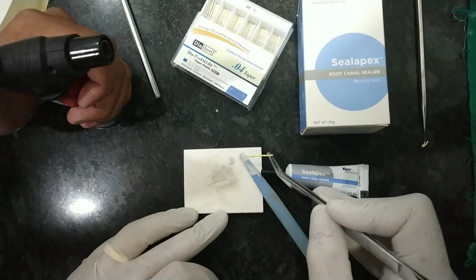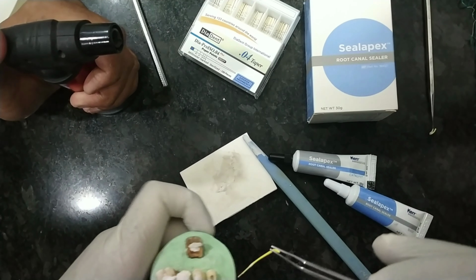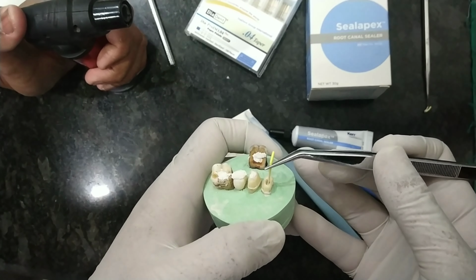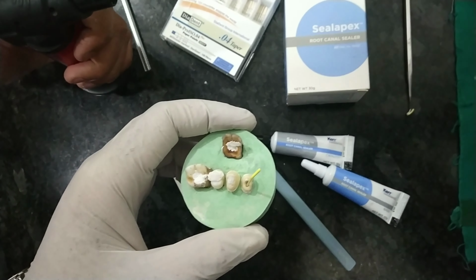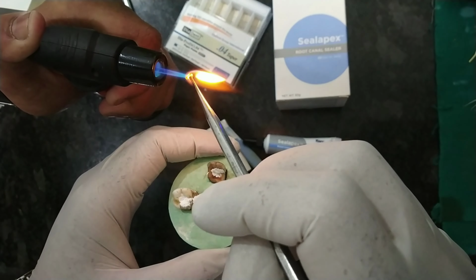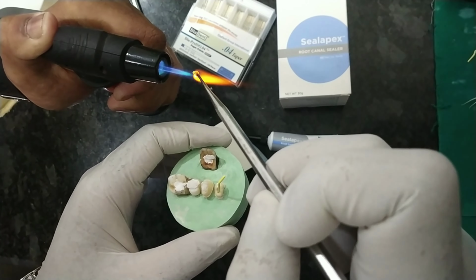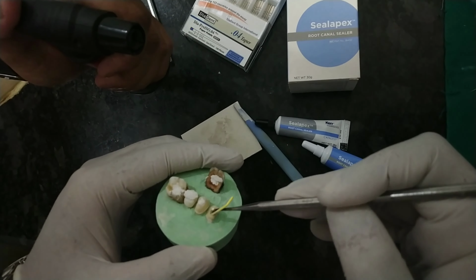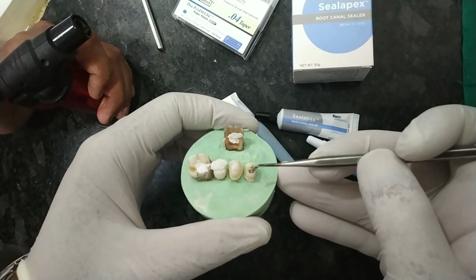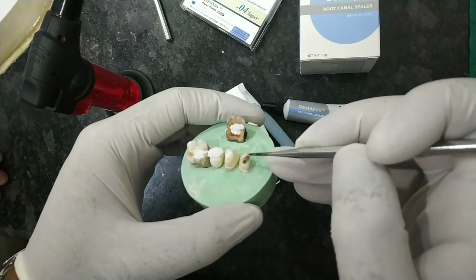So now again we are putting the sealer across the gutta percha, and now insert it into the canal. To work in a patient and to work in a dummy, there is a lot of difference. So to heat it red hot. And just little bit for a second, you have to just do this, and you have to be very careful in the patient's mouth. I suggest use the suction so that the smoke which is of the sealer which is coming out is get sucked by the suction. So now your tooth is sealed.